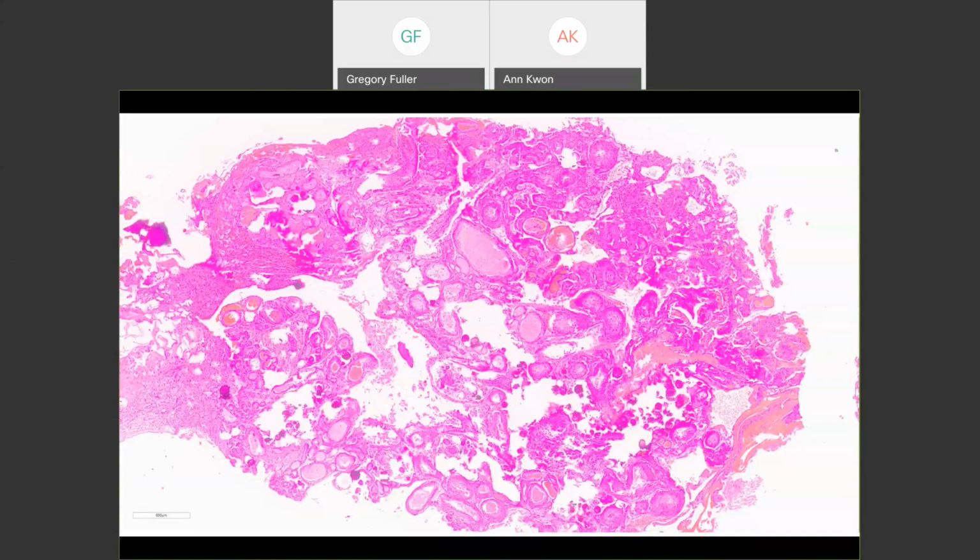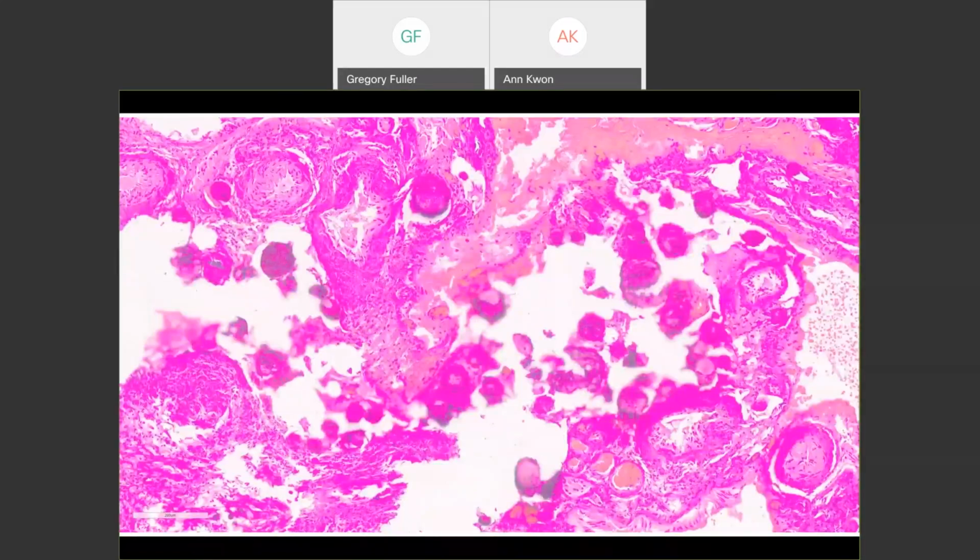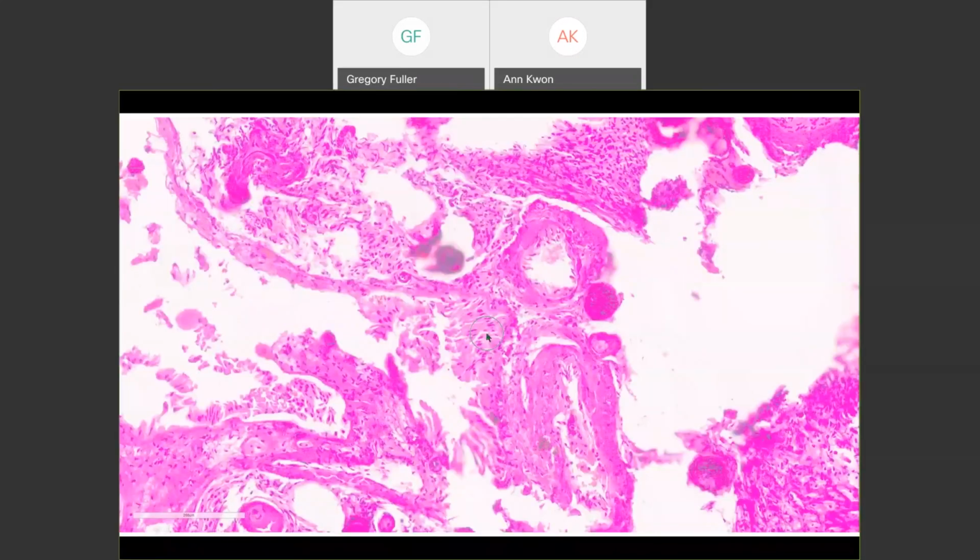So you know what I've just shown you? What I've just shown you is normal choroid plexus in the real surgical pathology world. It's going to be cauterized when the surgeon takes it. All right, a little bit higher power, again showing some psammoma bodies, and up to higher power like that. And then again, we'll call attention, see the epithelium, you're recognizing it now. This is what you're looking for.